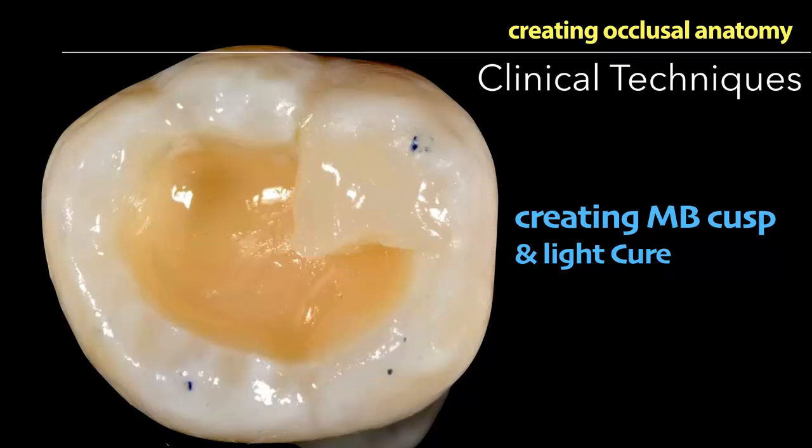You can use a bit of modeling liquid to adapt the cusp well, but don't increase the volume. It is the most uniform and easiest cusp to model, but we have to study the anatomy before doing this.